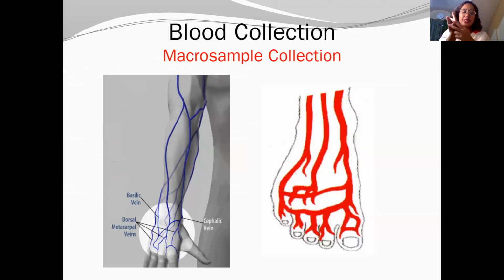And you can collect depending on the patient. Do not collect from spidery veins, varicose veins; you won't get anything from varicose veins. I tried extracting on varicose veins, nothing came out. So be careful with foot extraction in diabetic patients and in old people. You need to anchor properly when you extract from the hand and foot.